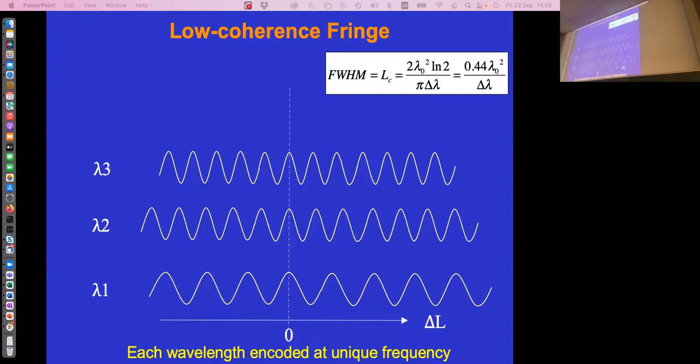So we got one of the bigger wavelengths, the super. Not really, because wavelength 1, this wavelength and this wavelength don't interfere. That's my derivation here. They're basically independent. That's the argument I'm trying to make: that the intensity of wavelength 3 and the intensity of wavelength 2 are completely independent from one another. Whether you will see this pattern for wavelength 2 does not depend on whether or not you turn on wavelength 3. But what I do see is the sum of these interference patterns.